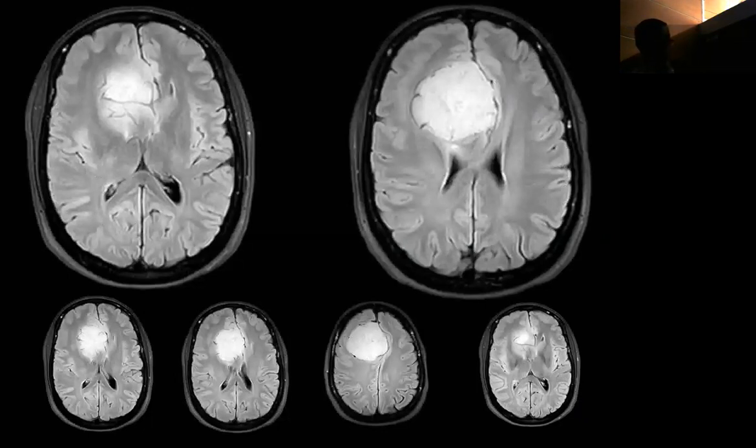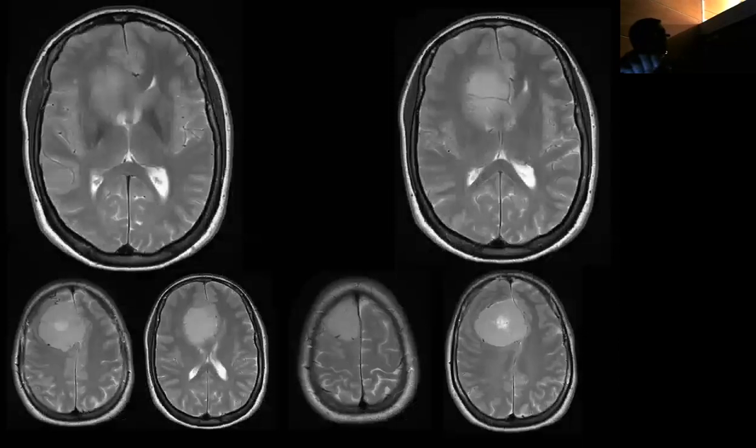And if you look at the surface of the tumor, so many vessels. It's very vascular. Again, you can see the beginning of the A-comm there and the branching of the A2 on the right side, the blood vessels on the surface.